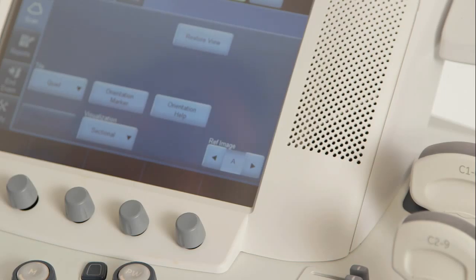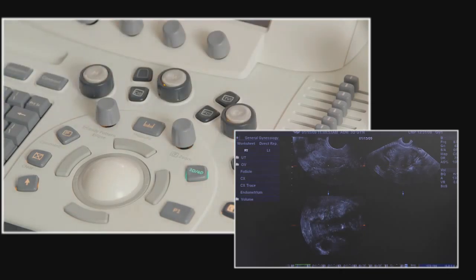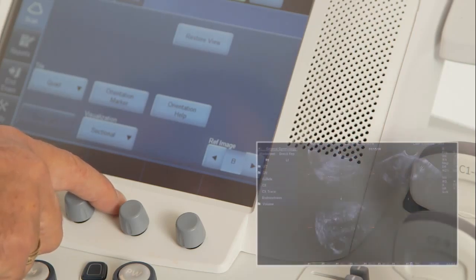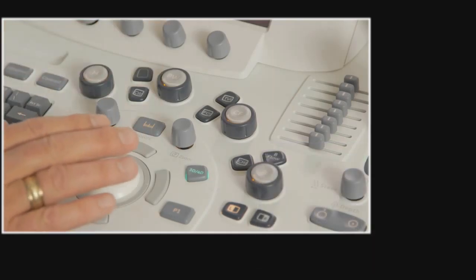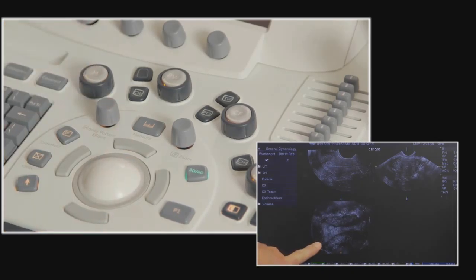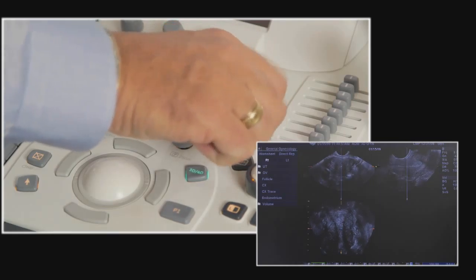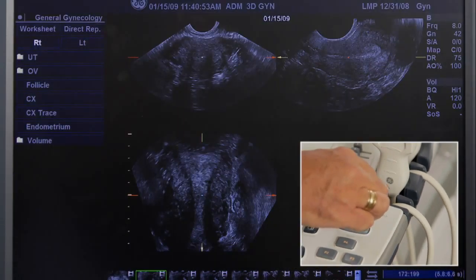Activate the A reference image and rotate until the endometrium is horizontal. Then activate the B reference image and do the same using the color flow or Z rotation knob. Then place the axis dot using the top trackball key in the endometrium or any area of interest. You will see a good representation of the coronal endometrium in the C plane. If you wish, you can rotate this image to be anatomically correct using the same color flow knob. To translate through the image, use the depth toggle.